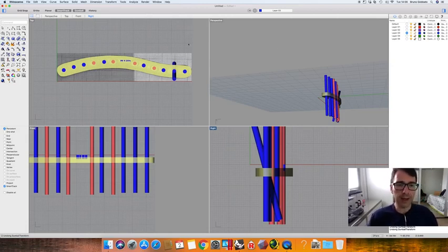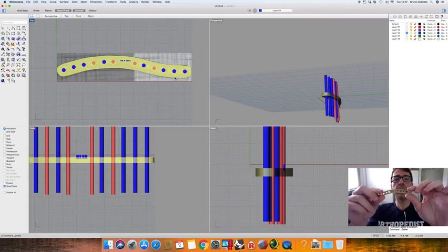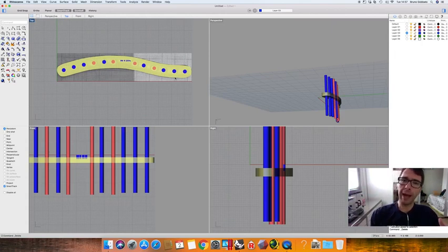When we have a plate that has many screws, this is important, but sometimes I opt not to draw all the inclined screws. Sometimes I just draw where they should be at 90 degrees, and I know they will have some inclination, so I know that maybe it will be a little different from what I plan, but for me what is important is the exact position in space.